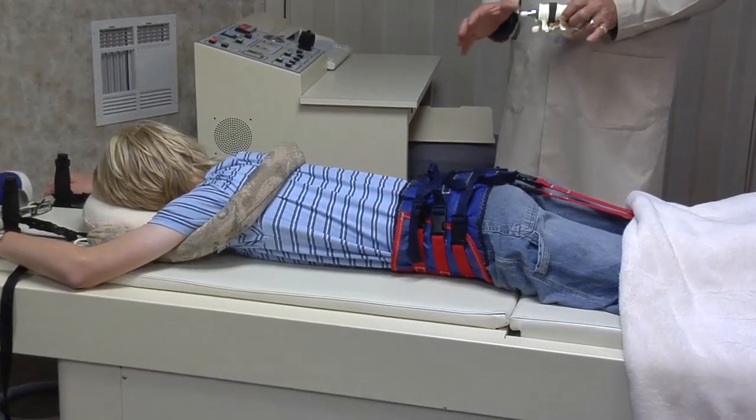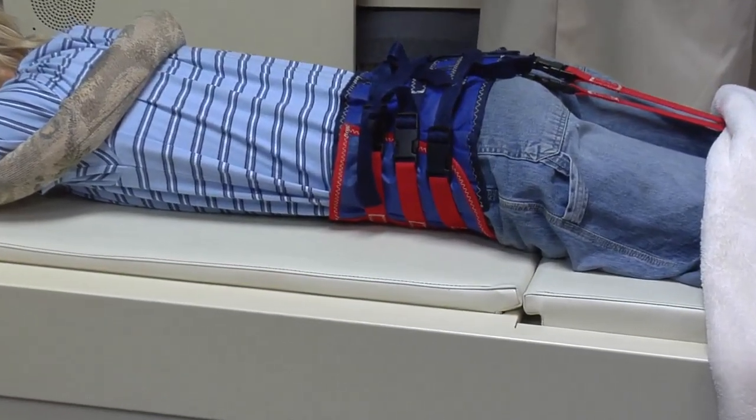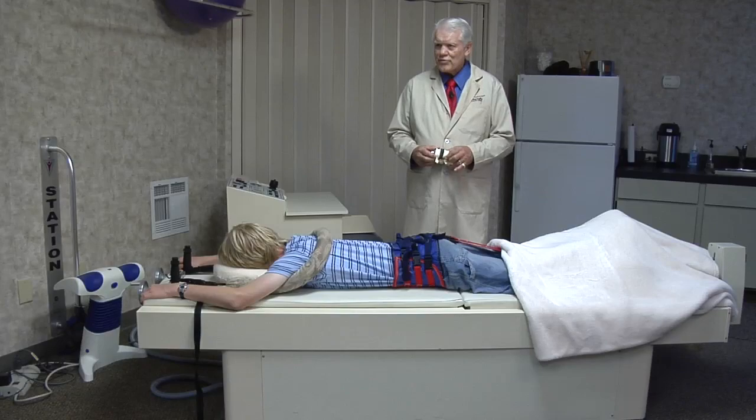It's an intensive treatment that works very well. There are no side effects, no risk, and it's very effective for many cases of chronic back pain. It offers new hope without surgery and without living on drugs.